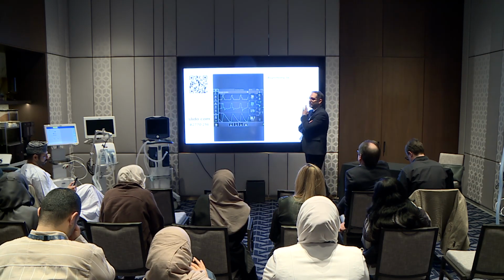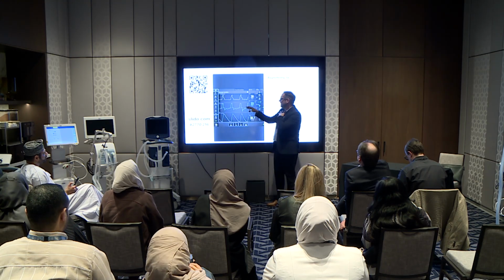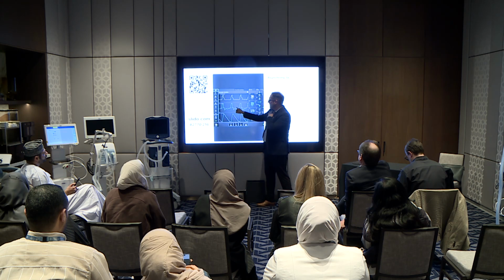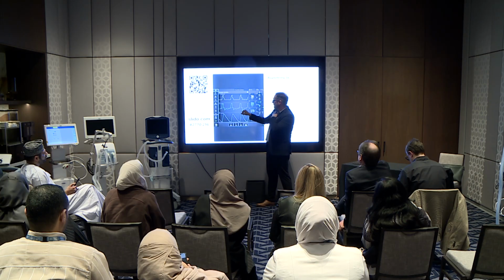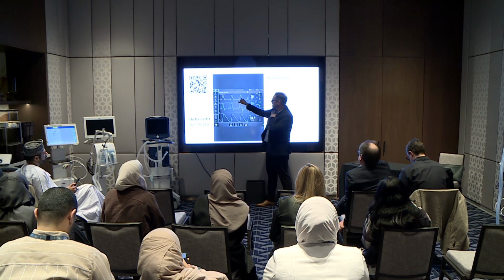So I'm just going to assume that some people thought ineffective efforts because they see this. I'm going to point out something. In this mode, I have set an inspiratory pause on purpose to detect plateau pressure. You see this plateau pressure here? Notice how there's no weird blip like you see here? That's normal. Look at these ones here.